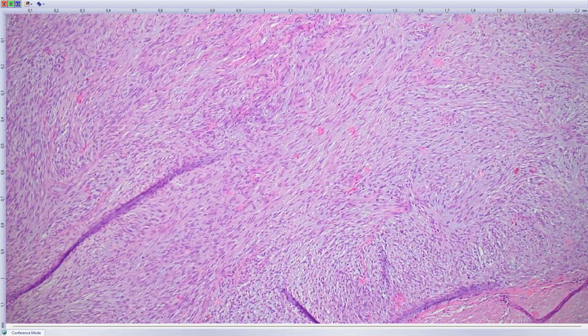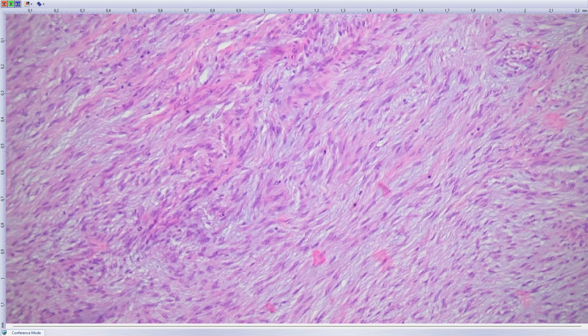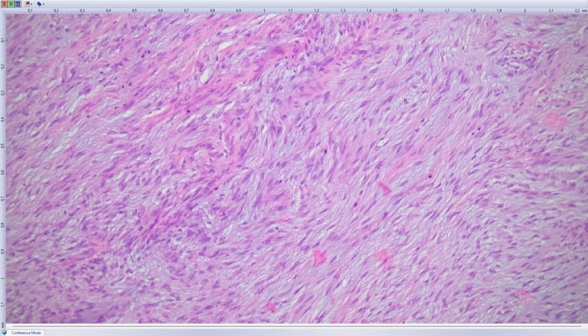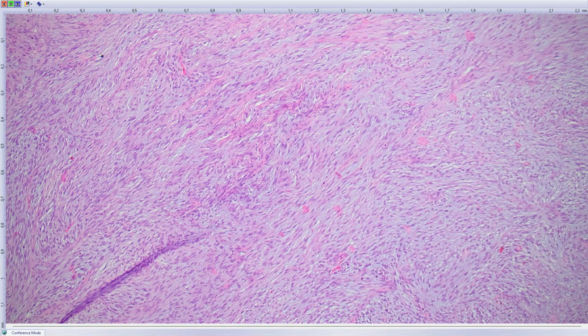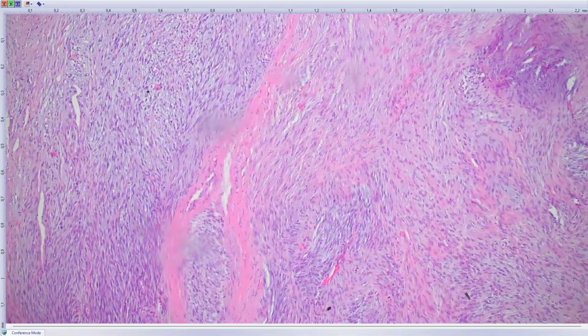These tumors, although the histopathology may not be as striking as in other high-grade stromal sarcoma types, this is really high-grade malignancy, a very aggressive one. So the clues to the diagnosis are many mitotic figures, not that typical smooth muscle appearance, and a little bit of myxoid appearance of the tumor in the background.